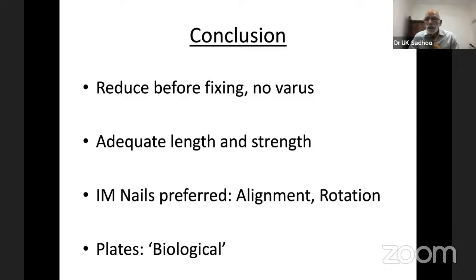I think it's the overall alignment of the fragment. You can see the proximal fragment going into flexion, abduction and external rotation, whereas in lateral position the limb tends to fall into varus and the foot goes into internal rotation. So while you are reaming or reducing, you need some kind of hold on that fragment.